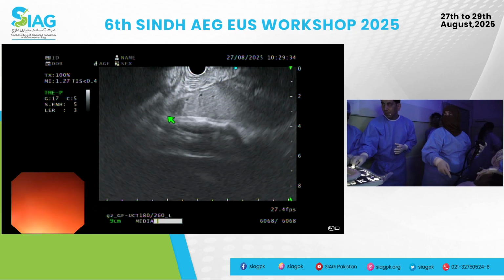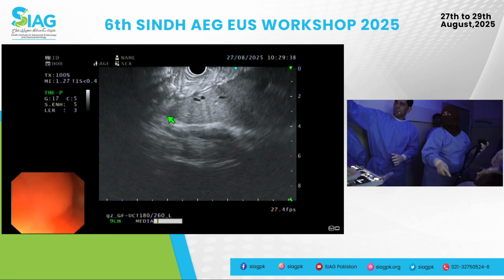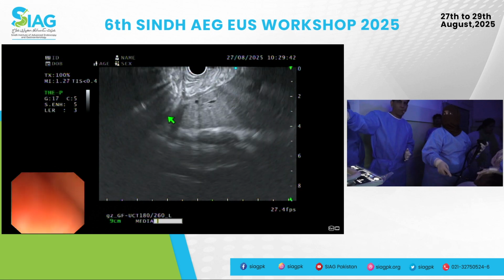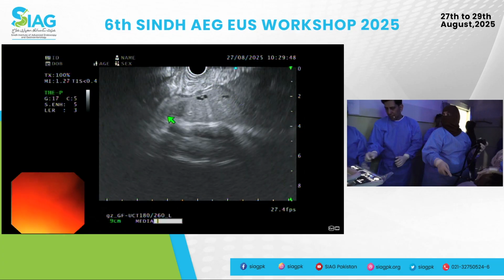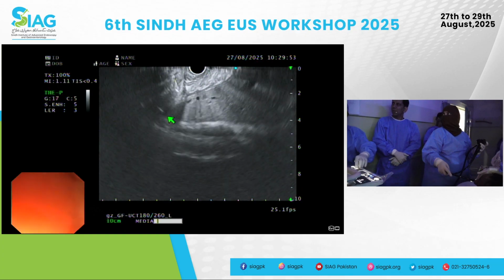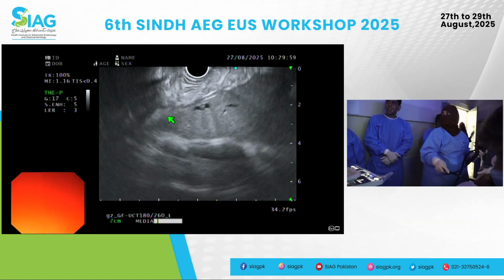Unfreeze this please. Good. Okay. Now the second thing is to see that it's going from 0 to 8, and this bit of the screen is of no use to us. Correct, exactly. So reduce it to maybe 4 centimeter. Reduce the depth, please. Reduce. You are increasing. A bit more. That's good. That's fine. Excellent. That doesn't look too bad.